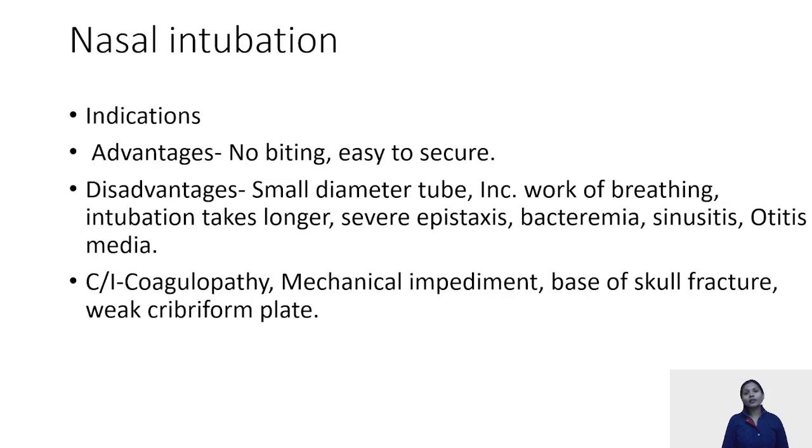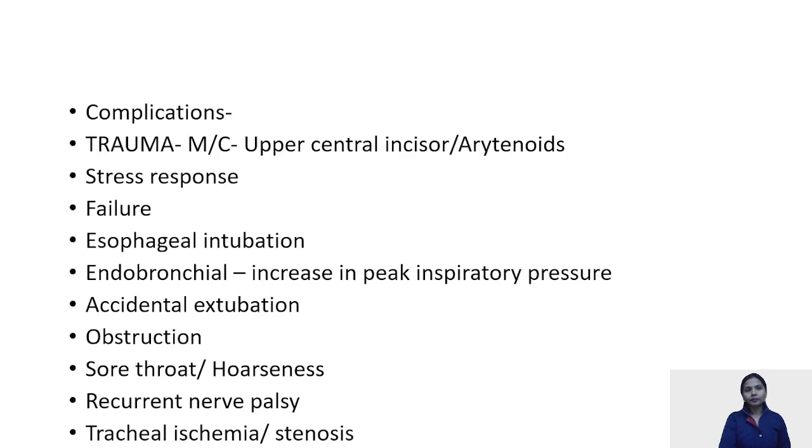You can have epistaxis, bacteremia, sinusitis, and otitis media as complications of nasal intubation. The contraindications of nasal intubation are almost similar to what we had studied for NPA: basilar skull fractures, coagulopathy, or any anatomical or mechanical impediment in the insertion of the nasal tubes.